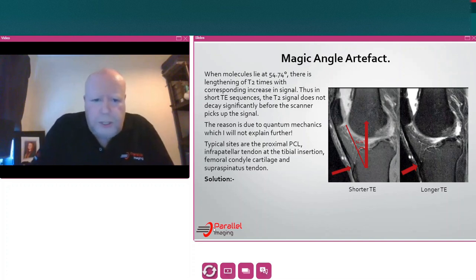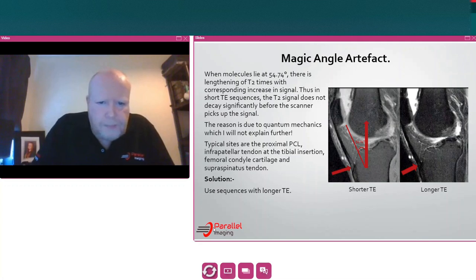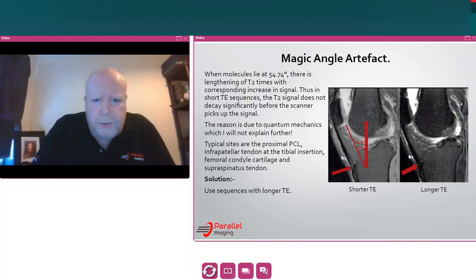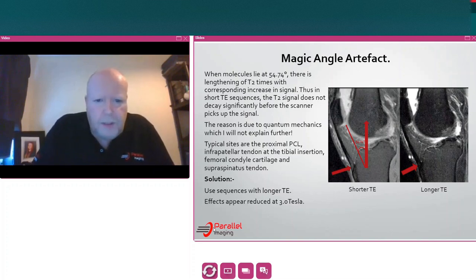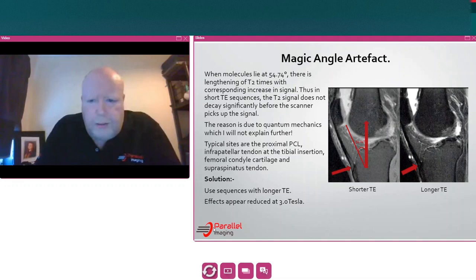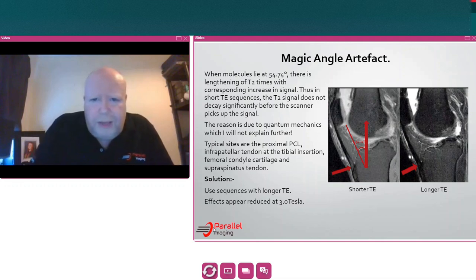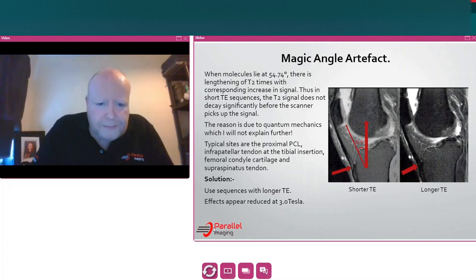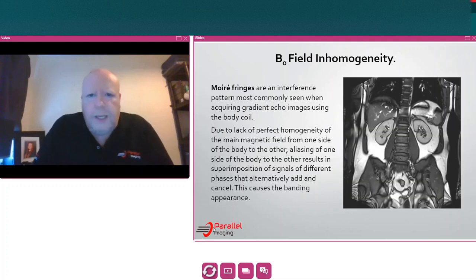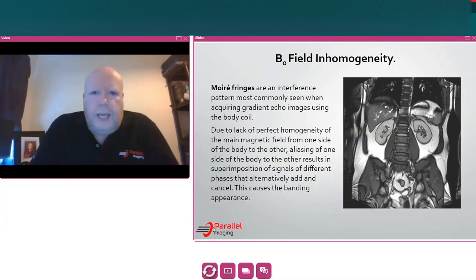Typical sites for magic angle artefact are the proximal posterior cruciate ligaments, the infrapatellar tendon at the tibial insertion, the femoral condyle cartilage, and the supraspinatus tendon. Solutions: use sequences with a longer TE. Also, this effect appears much less at 3 Tesla if you have access to such a system.